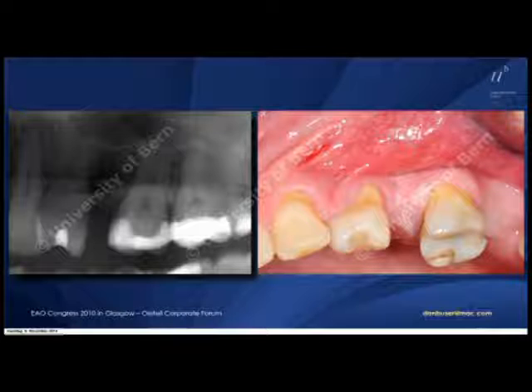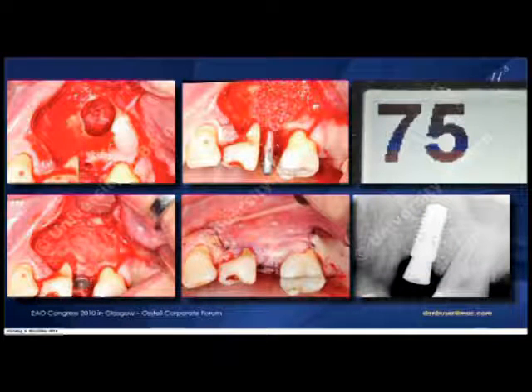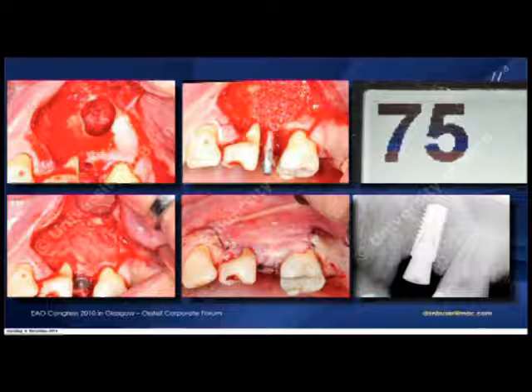Since we had a limited space here, we had to use a bone level implant, which has a smaller diameter, as you can see. And since we had about 6-7 millimeters of remaining bone height, we could then place a 12 millimeter implant. You see that the ISQ level was pretty good, 75. So that's for sure a case where you can expect that at 8 weeks it should be sufficiently mature.